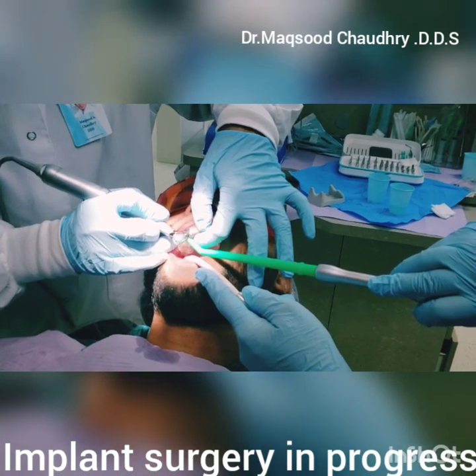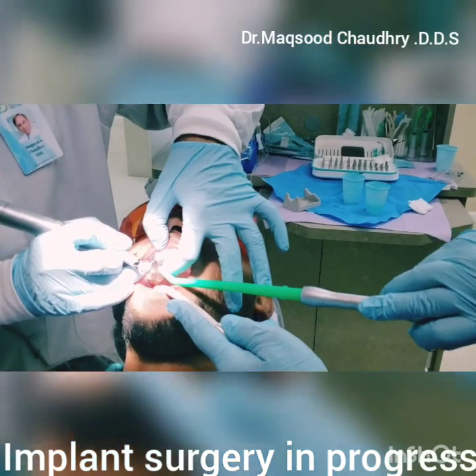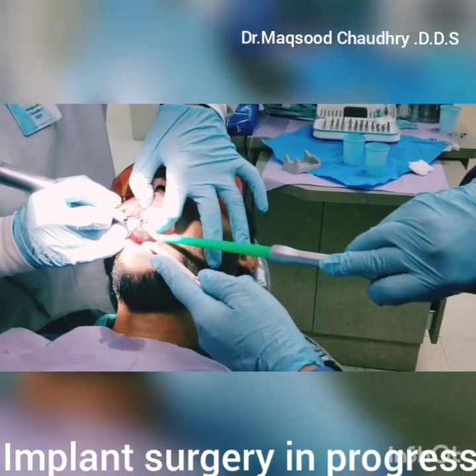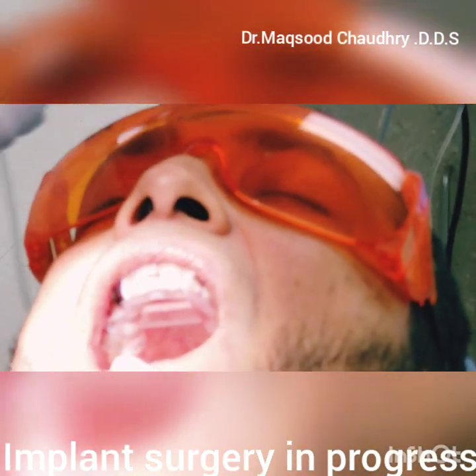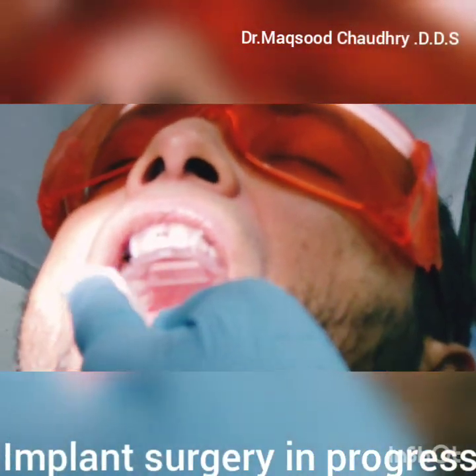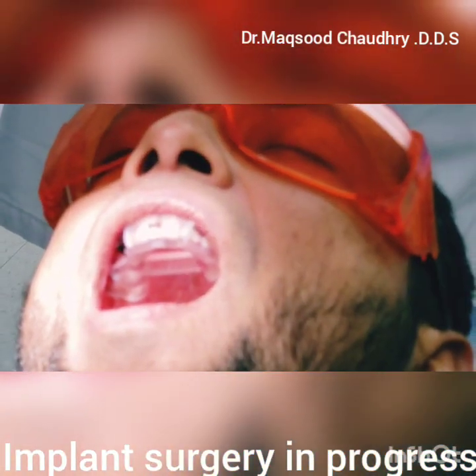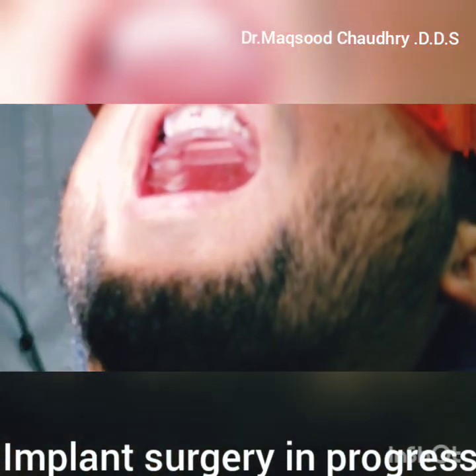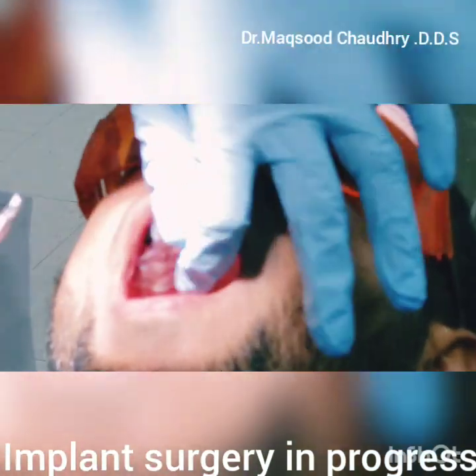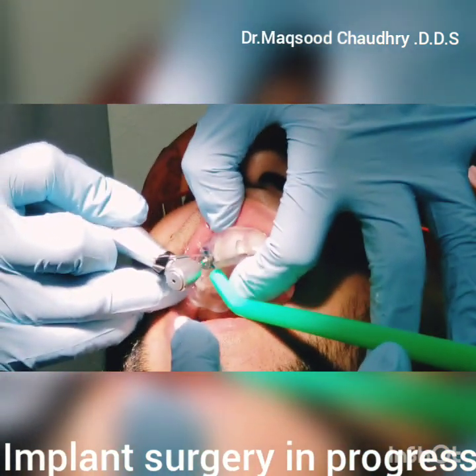There's a lot of water needed for the irrigation. We are using saline. Osteotomy is almost done now. We are going to be inserting the implant body very soon.